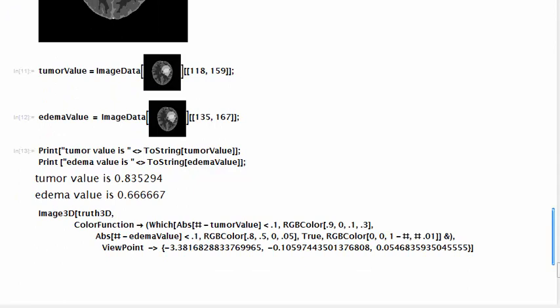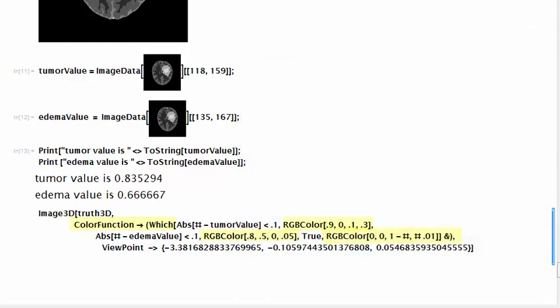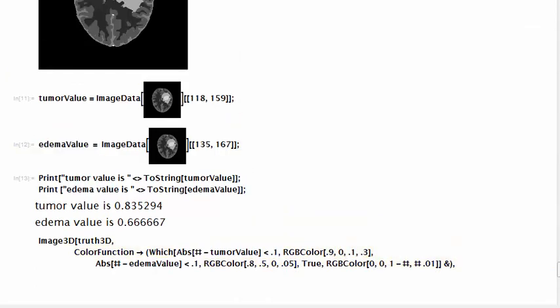Once we know the gray levels for tumor and edema, we can assign colors and transparency to them by defining rules for color function that we can see here as RGB alpha specifications. Using the function which, we assign a red color to tumor voxels, a yellowish color to edema, and a blue transparent color to everything else in the brain.